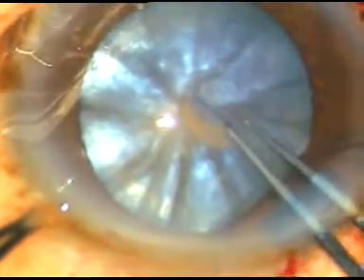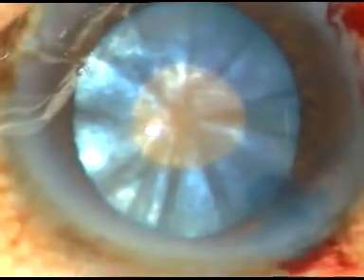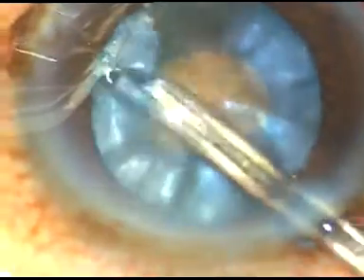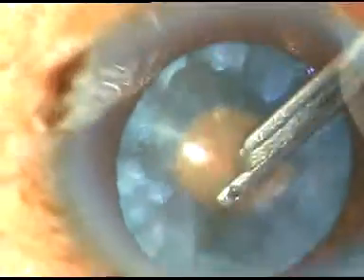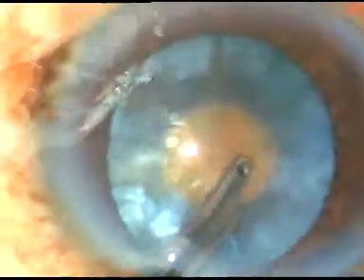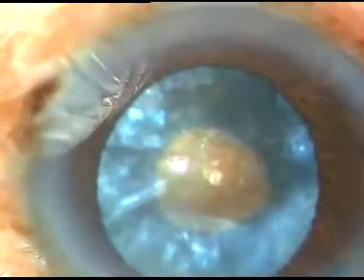A little bit of viscoelastic is removed and a very small rhexis is done. With a Simcoe cannula, some cortical lens matter is removed. The cortex is squeezed from the periphery to come out through this small opening at the center. You can use bimanual irrigation-aspiration for removal of cortical lens matter. The idea is to reduce the intralenticular pressure — when we remove the cortical matter like this, the intralenticular pressure is reduced drastically, and the shrew is tamed.